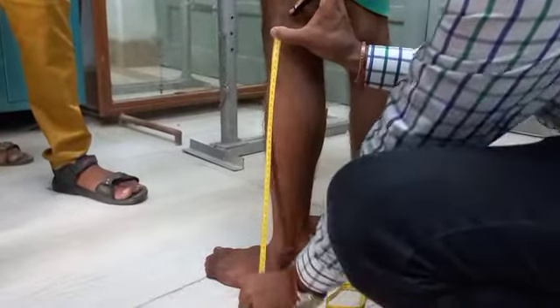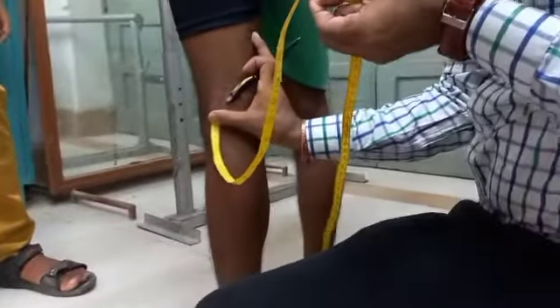This is the position of our knee axis, right? So our knee axis position is at this level. From there I will take the vertical measurement, keeping my measuring tape vertical. This is 46.4. Okay, so I have the measurement of IT to floor and knee to floor, so I have the other measurement and need not measure it.